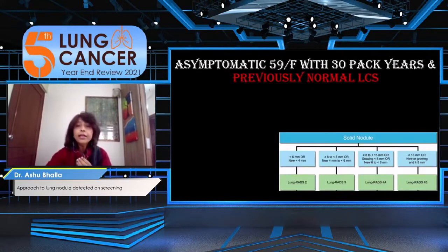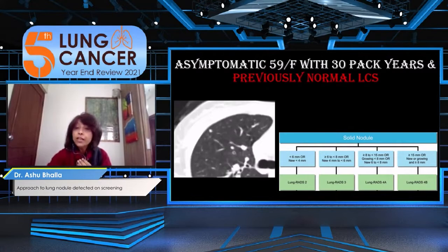And similarly, new nodules. So this is a previously normal LCS. If you first detect this nodule, it will not be significant.